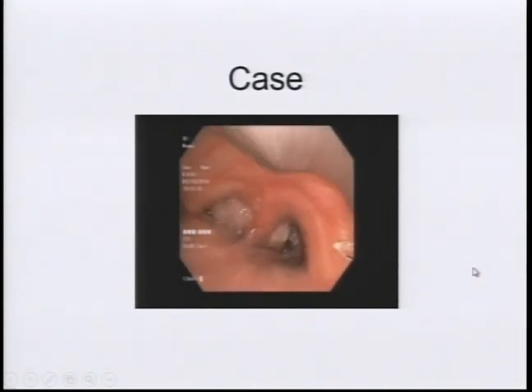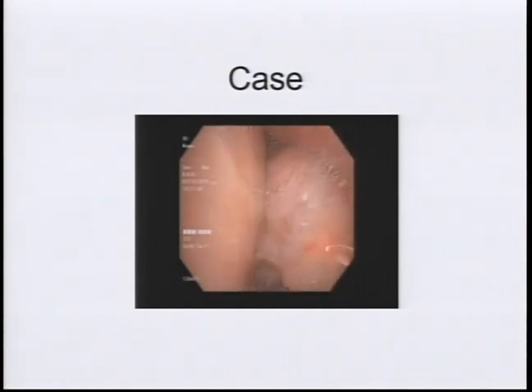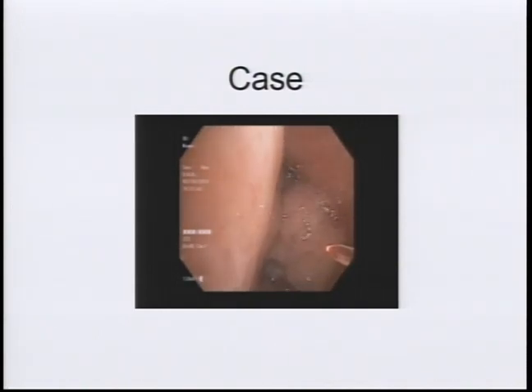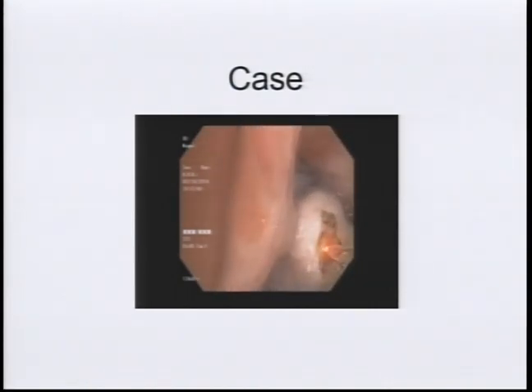So here we're using a laser. So this is one of the hot therapies that I mentioned earlier. So what this does is it cuts and cauterizes tumor. So this would prevent it from bleeding as you core it out, and allows you to cut it out essentially without creating a lot of bleeding. So this is deceiving. It looks as if it's very superficial, but it has about a 1 centimeter depth of penetration. So you can treat the tumor and then excise it with minimal bleeding.